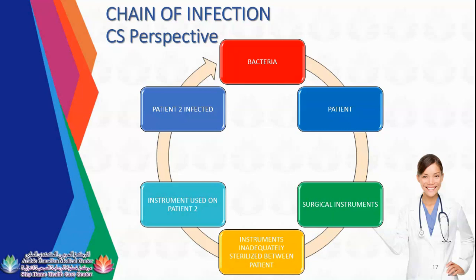Once in the third link of the chain of infection in the CS perspective, your surgical instrument is contaminated with pathogens and you, as a CSSD technician, did not properly follow the protocols in CSSD. You did not do the manual brushing, you just directly put the instruments in the ultrasonic machine. Then you are risking everybody with other diseases or by contracting the same disease. Then, once you sterilize the instrument and it's not adequately clean, it is used on the second patient, and your second patient will be infected.